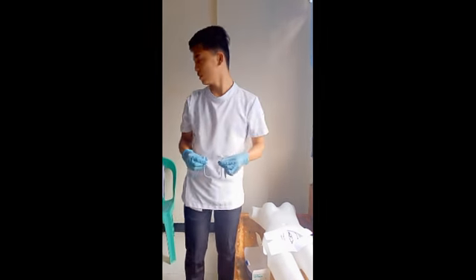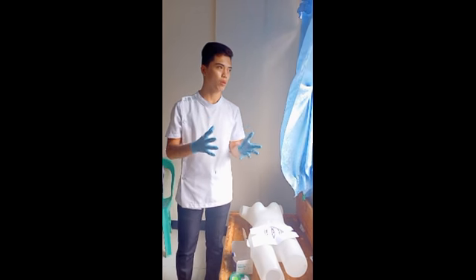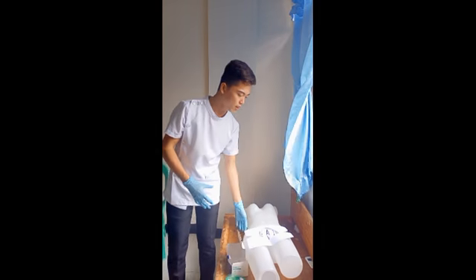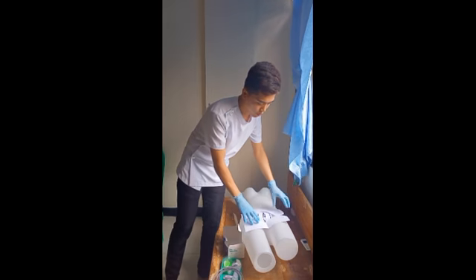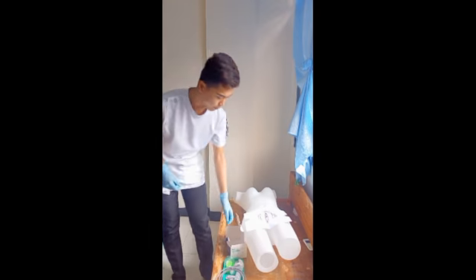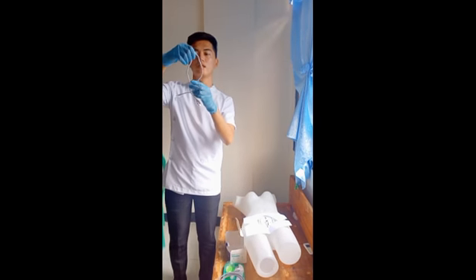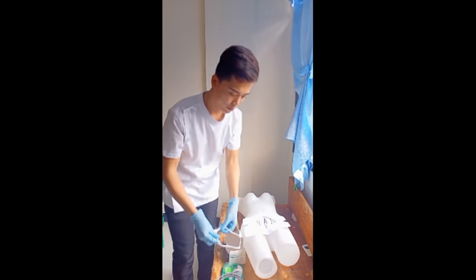I'm sorry, I'm going to correct what I called this. This is the sterile drapes. This is the sterile drapes to protect the entire procedure of the patient. The next is the urinary catheter. This is important, and this is used in the catheterization.